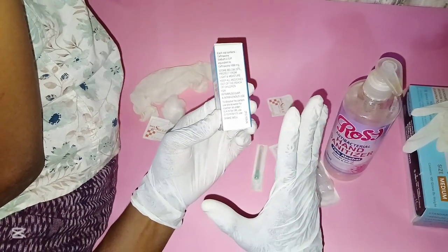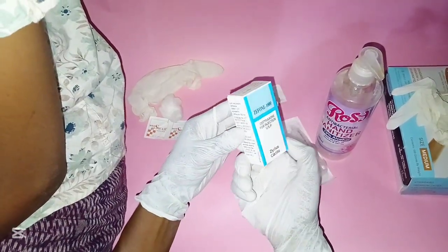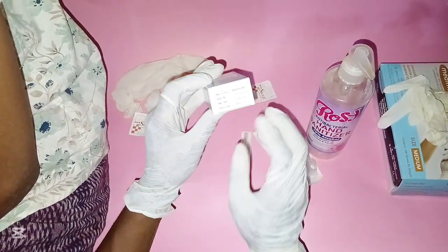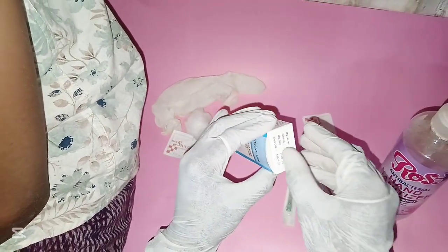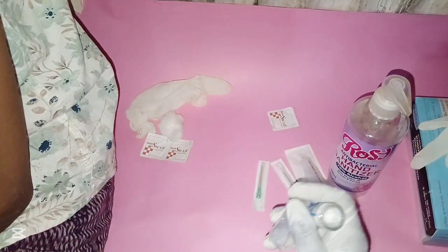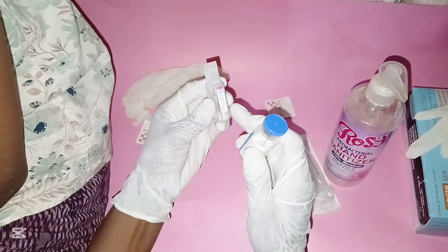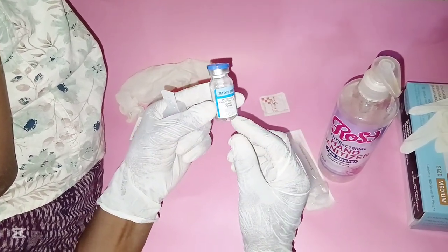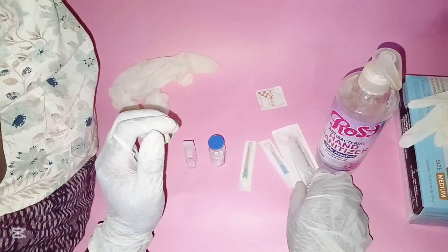In either case, first check the expiry date of the drug. Then open the packaging — you will find a plastic vial containing 10 ml of sterile water for injection, and a vial containing the white powder of IM or IV ceftriaxone.